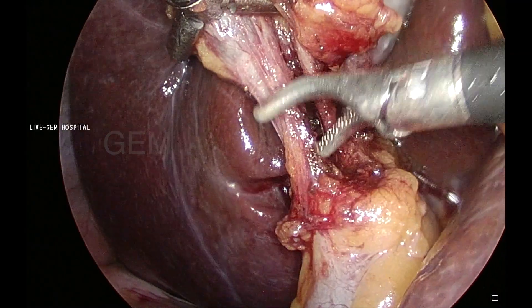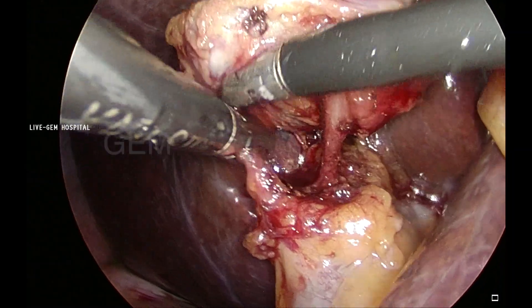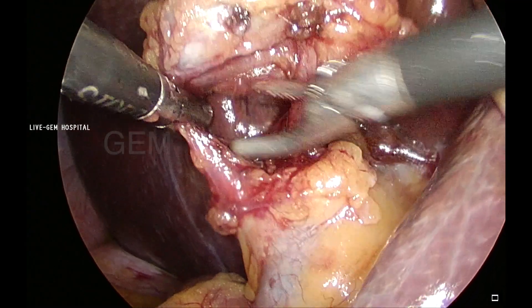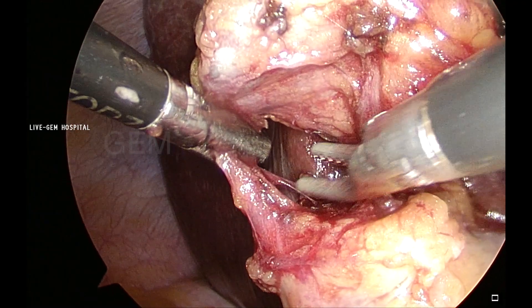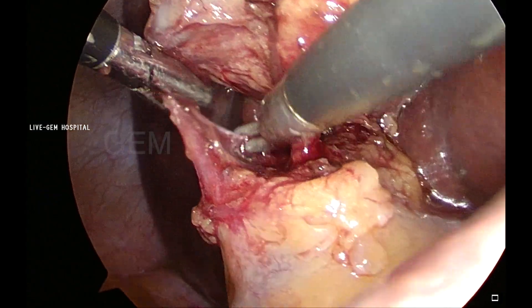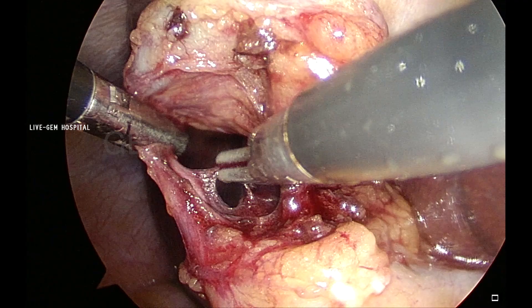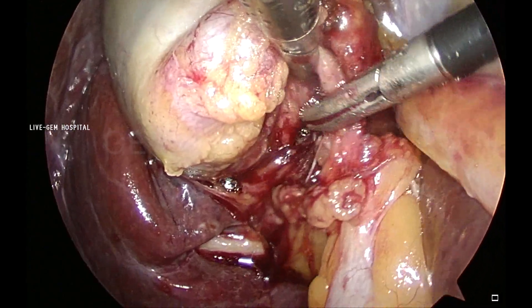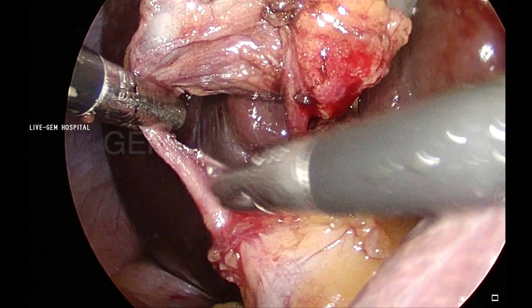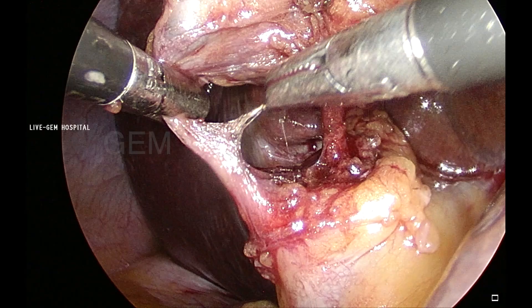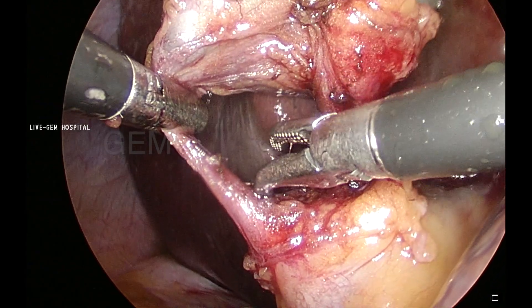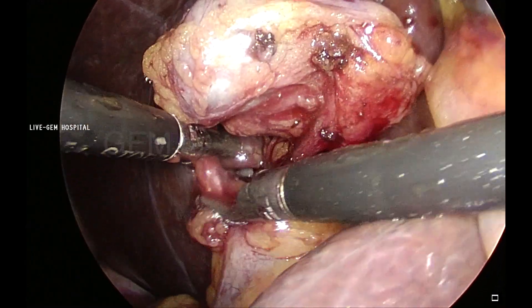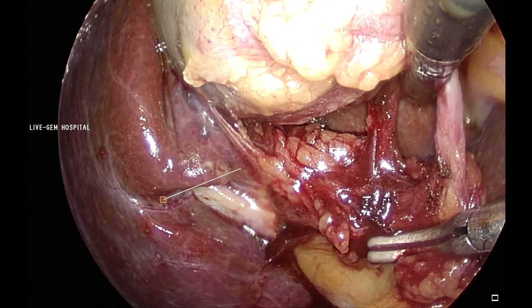Starting from traction method 1, 2, 3 — I am showing different ways to expose the Calot's in case you have exposure difficulties. Milking it out — that is the common bile duct. I can come a little down and all these small posterior attachments can be separated. Minimal cautery — you should not apply it continuously, only a fraction of a second. These are all small vessels and peritoneal attachments. It looks like a broad cystic duct because of the attachment, but there is another vessel there. All vessels and attachments can be divided safely because our exposure is good. Even though it is close to the cystic duct-CBD junction — called the danger zone — we are away from the danger zone.